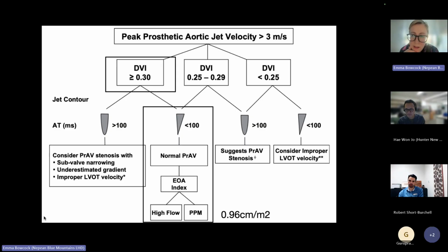So I think it just shows that we need to integrate what we're finding in the clinical context. Everything's individualized, but I think the echo did help his management. And then it's about trending, right? So choosing what you're going to do, instituting that, and then seeing how your treatment impacts the parameters that you're seeing. And that's the end of cases for today.